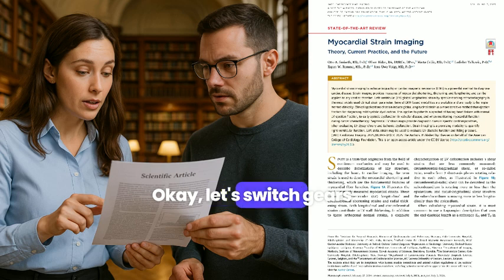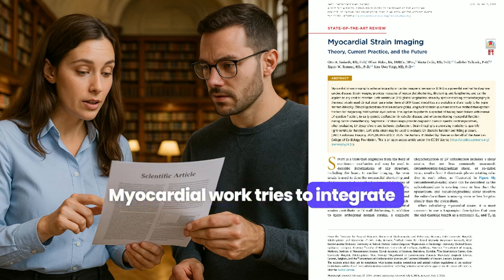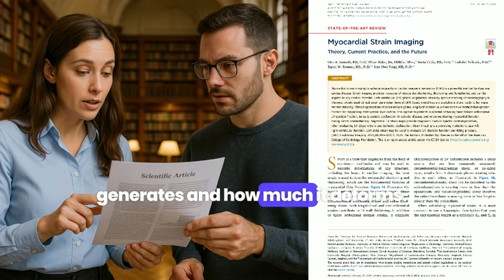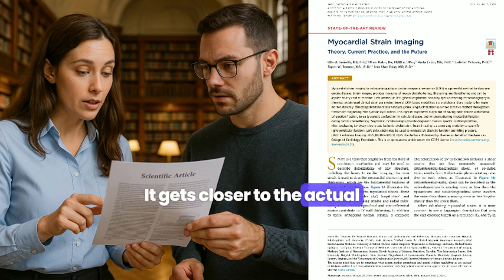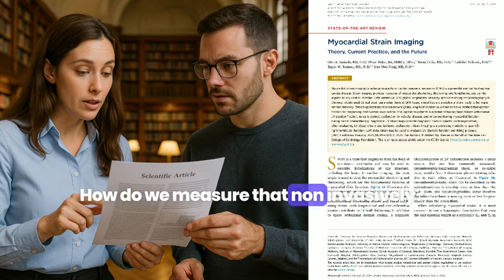Okay. Let's switch gears to myocardial work. That sounds like a step beyond just deformation. It is. Myocardial work tries to integrate both the force the muscle generates and how much it deforms. It gets closer to the actual energy expenditure, the oxygen consumption of the heart. How do we measure that non-invasively?